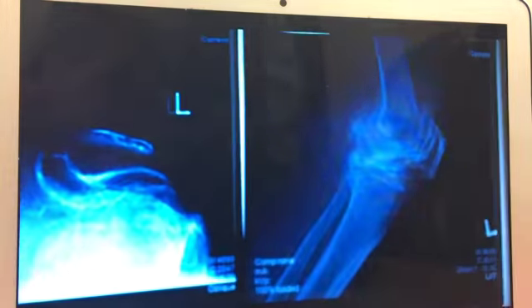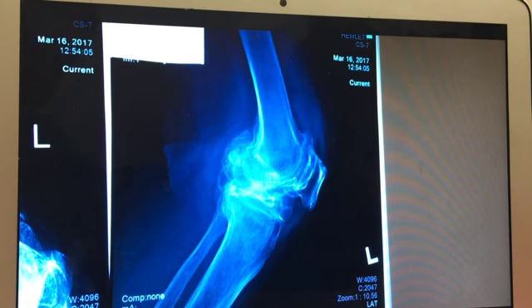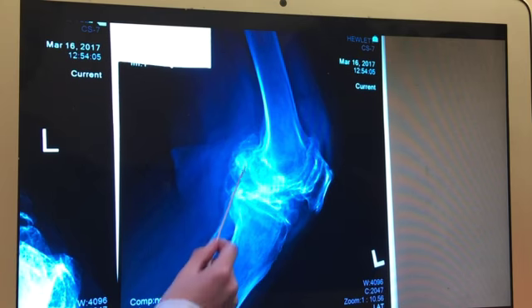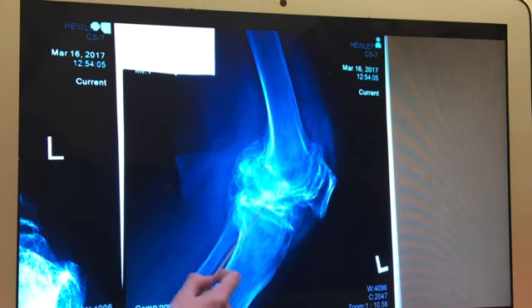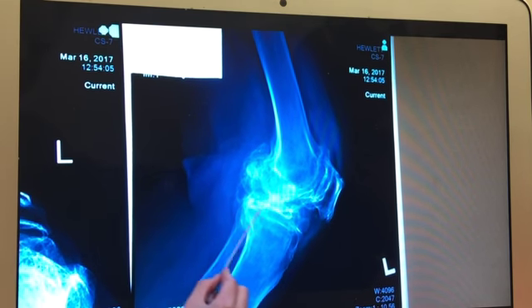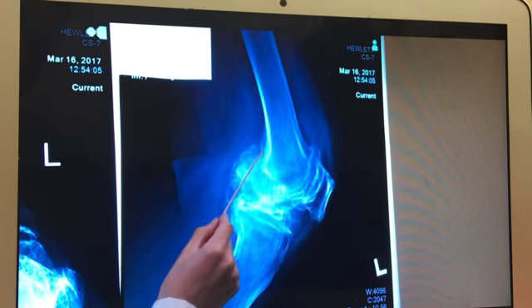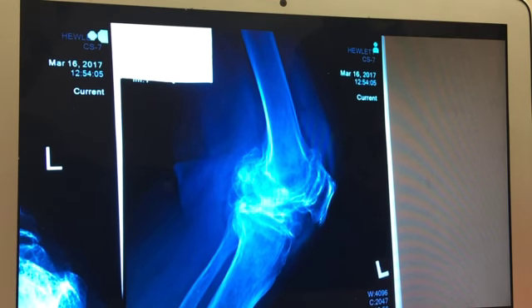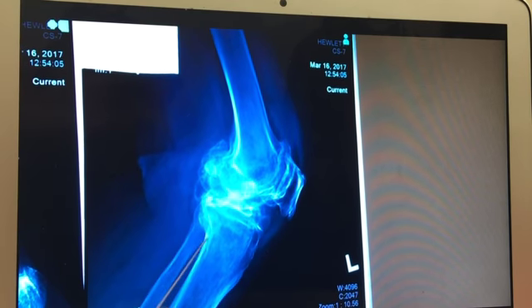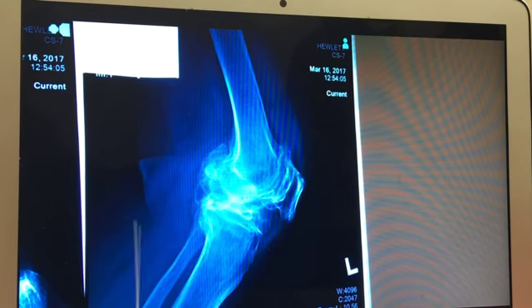Next, we're moving on to the lateral. Here, I want to talk about the rotational errors first. It's a little bit difficult to see the rotational errors because there is so much bone growth, but as you can tell here, the epicondyles aren't completely superimposed, and by the evidence of the adductor tubercle posteriorly, this means that there was not enough rotation. This is also evidenced by most of the fibular head being superimposed by the tibia. So I should have rotated the patient more laterally.